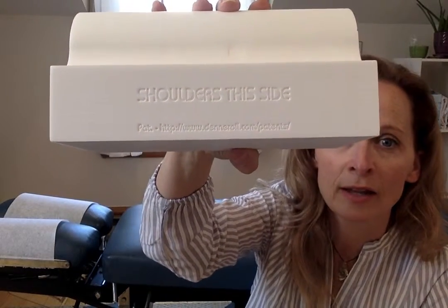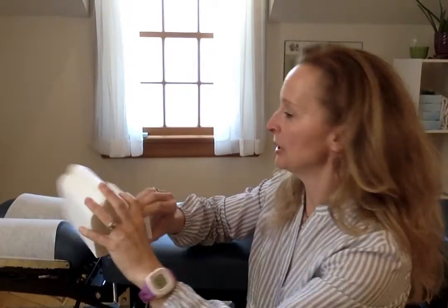On this side here, I'm going to hold it up really close to the camera. You can see that it says shoulders this side. That means that this is going to go against your shoulders here. So it's going to look like that. Now, I'm just going to place it on the table here. I'm going to show you how to use this on my chiropractic table.